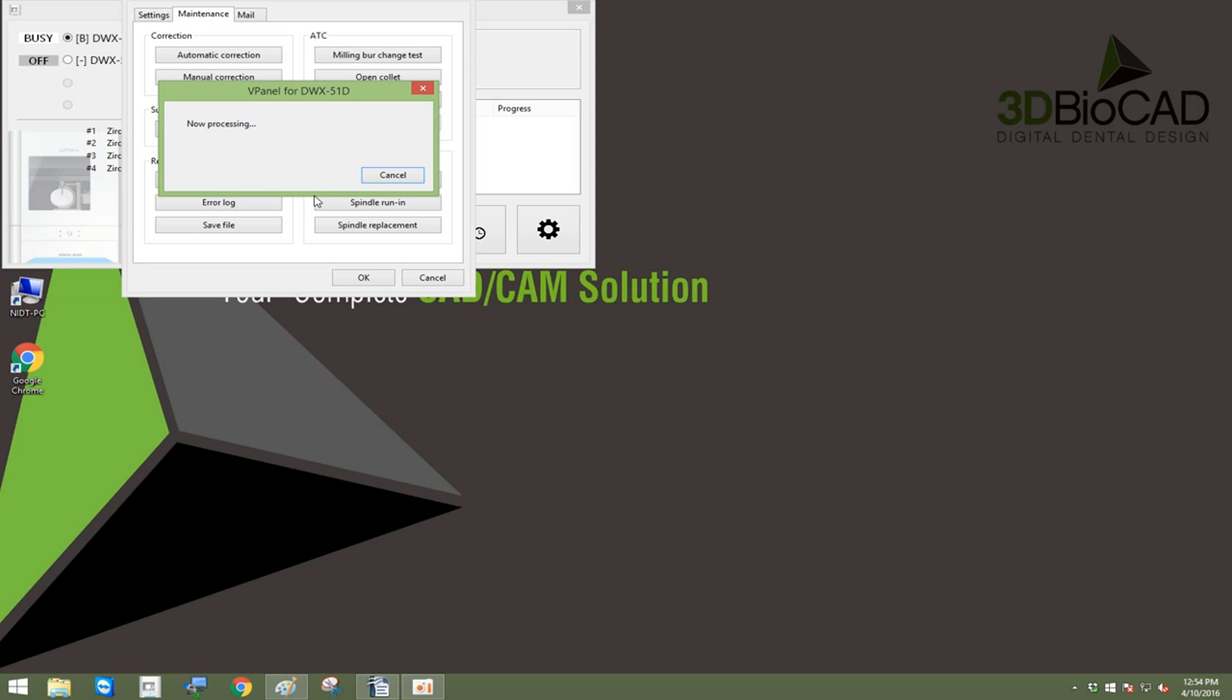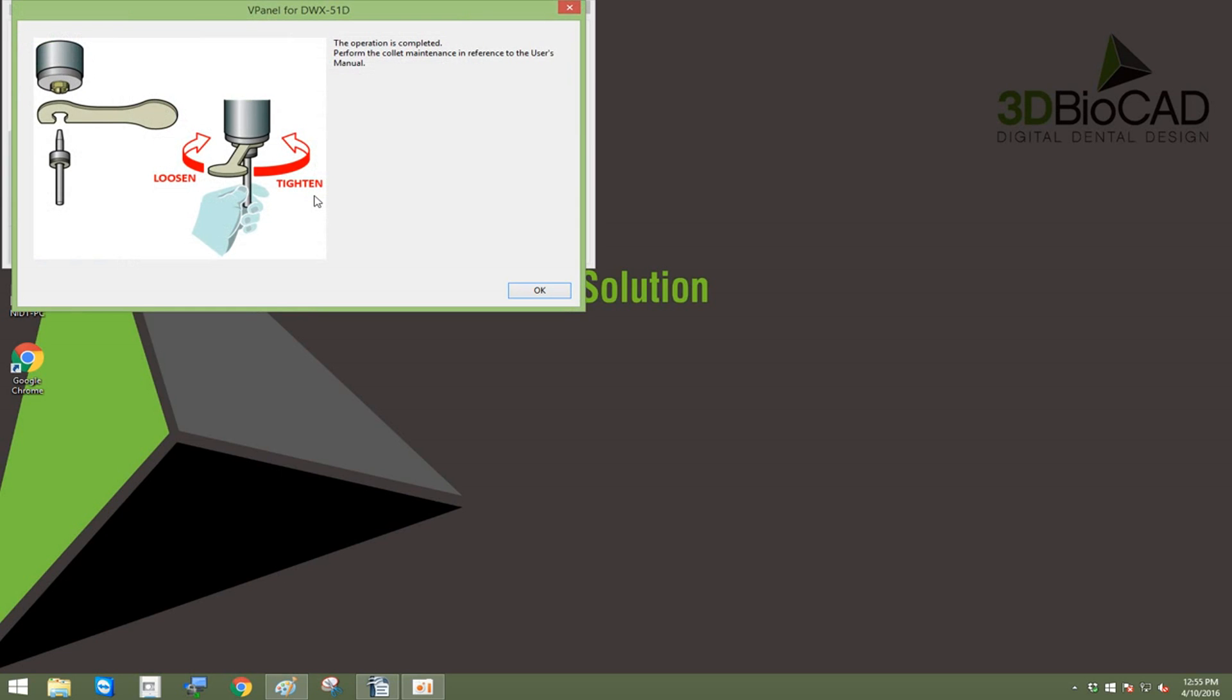At this point you will see the machine working. Then once the instructions pop up, you can open the door and begin tightening or loosening your collet.